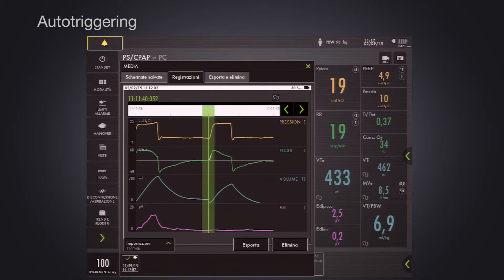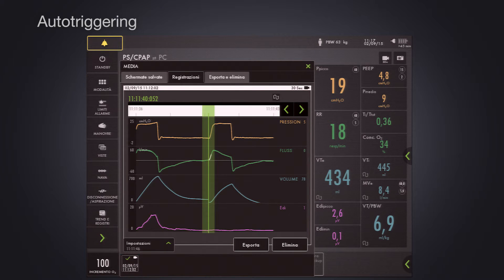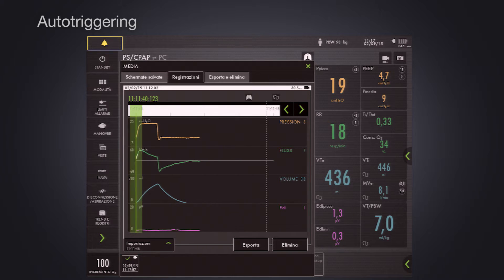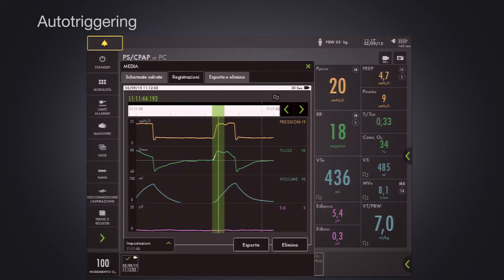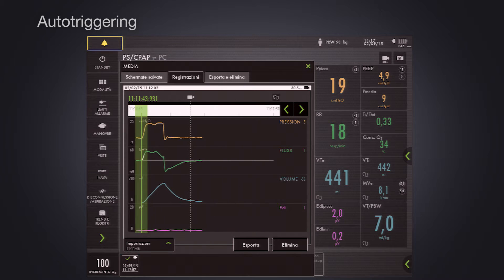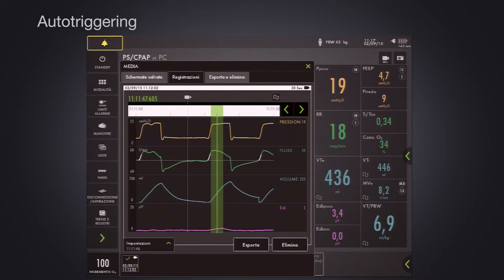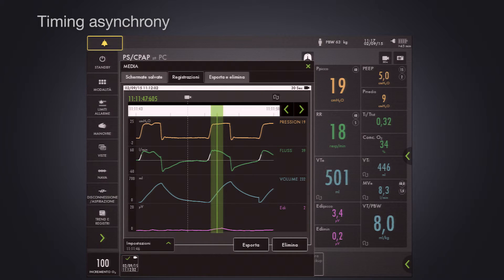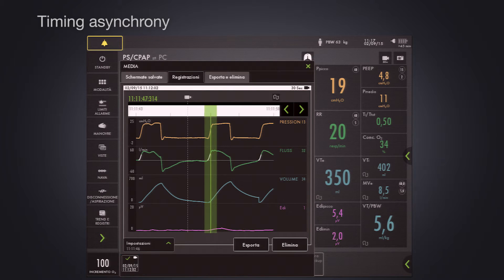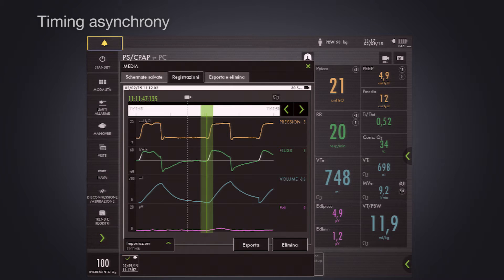Here is an example of auto-triggering — no trigger from the patient but a trigger from the ventilator. And here is another one: no trigger from the patient, trigger from the ventilator — auto-triggering. This example shows small diaphragm activity with a timing asynchrony.